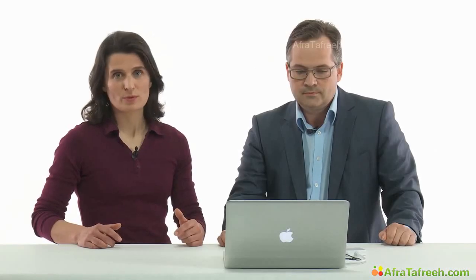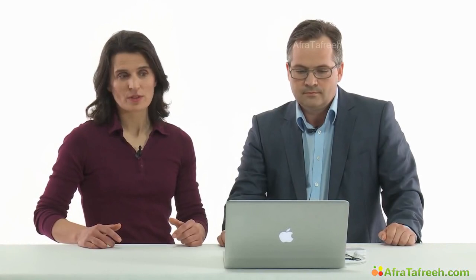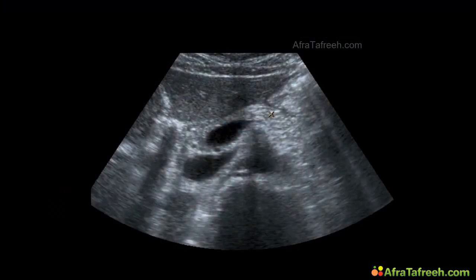We get the transverse view now, the transverse epigastric view, and place our transducer in the epigastric area, as I showed you on the torso before. And see what? Now we are always on the left side, so we see the left liver lobe over here, and even the last tip of it over here. Which is very important to see, really the tip of the left liver lobe, in order not to overlook some masses or tumors.